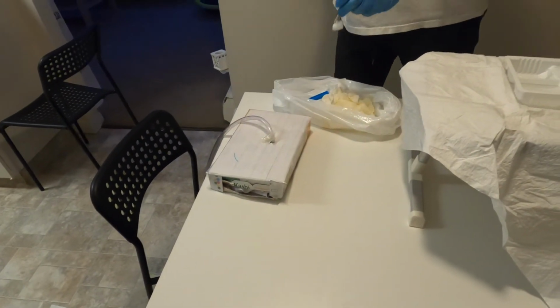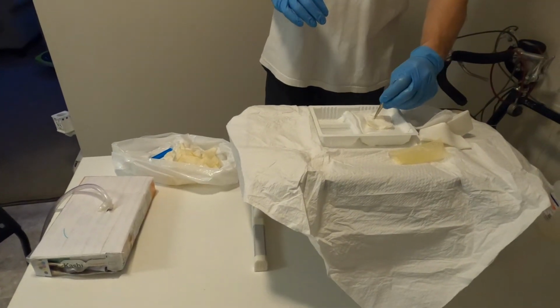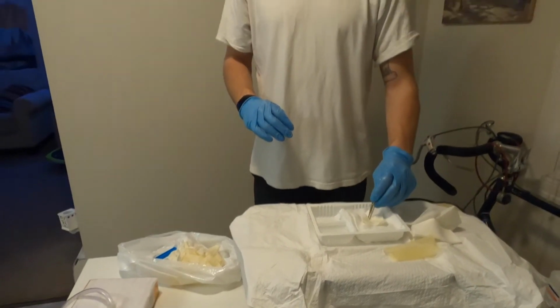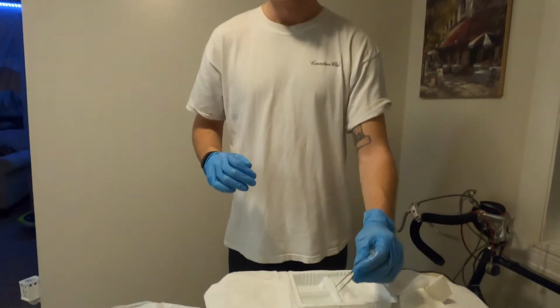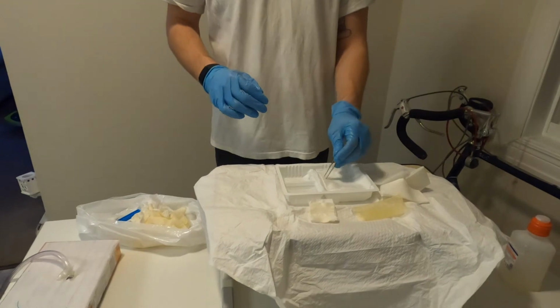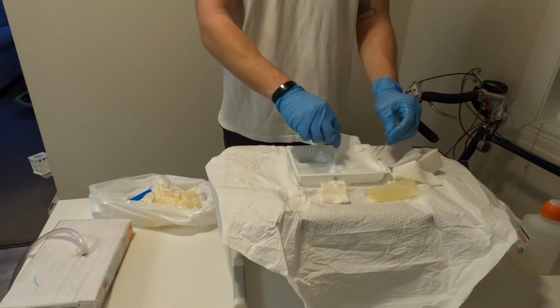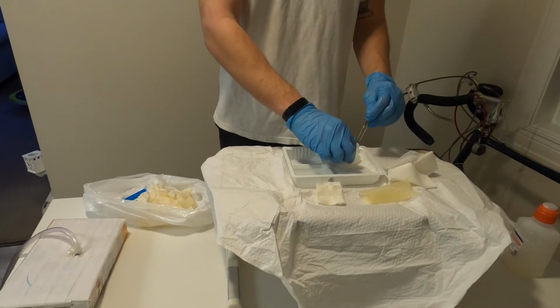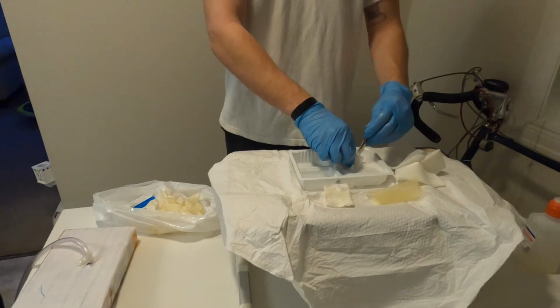Again, one thing I forgot to mention before I started here is I'd make sure the patient is in semi-Fowler's position. And if they can, raise their arm above their head. Forgot to mention that before, but that's something I would do prior to beginning cleaning here. So you can actually just use my hand straight up here.